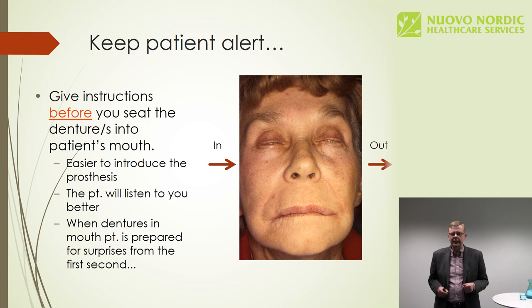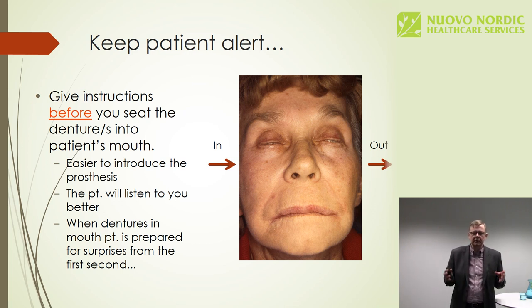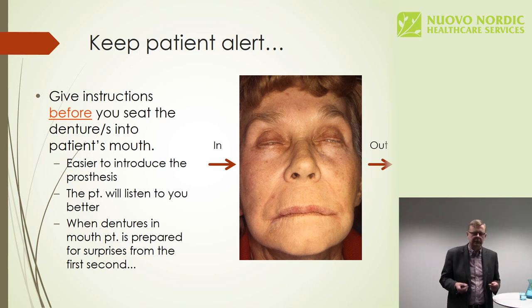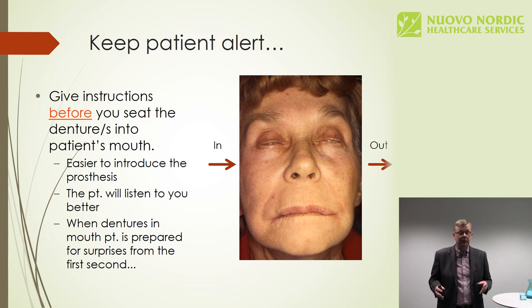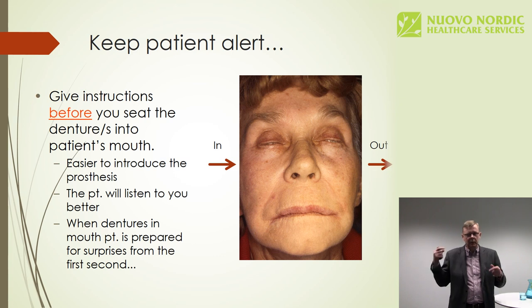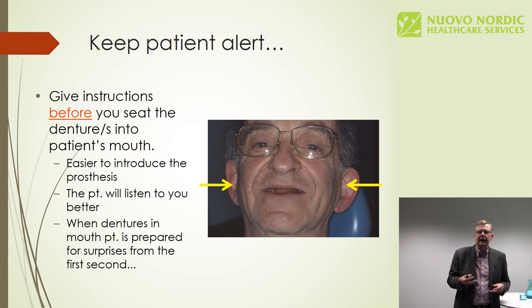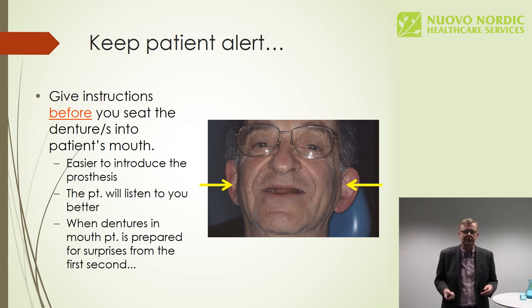When the patient is seated in the dentist chair and you start giving the instructions, make sure and remember, don't seat the dentures into the patient's mouth, but hold them in your hand. It's much easier to show the different things, cleaning, brushing the denture, when the denture is in your hand. And before all, if you seat the denture into the patient's mouth and then start instructing the patient, the patient won't hear anything. The information will go in one ear and out the other. It's only the dentures the patients know. They are the new things in the mouth. He's confused, doesn't remember anything you're telling him. You will hold the dentures in your hand and give the instructions, and the patient will be more concentrated and listen to you.